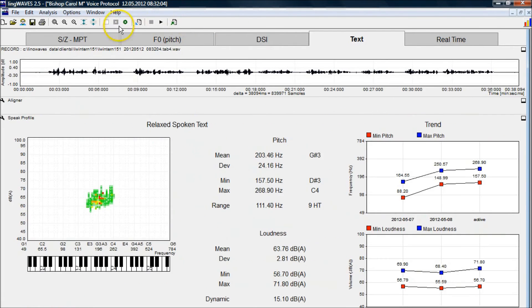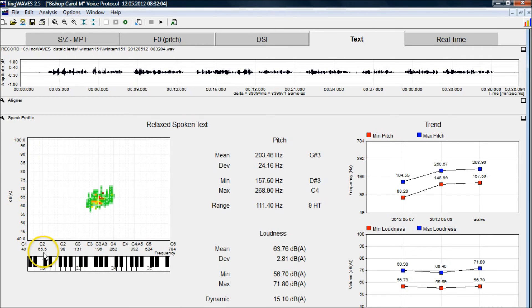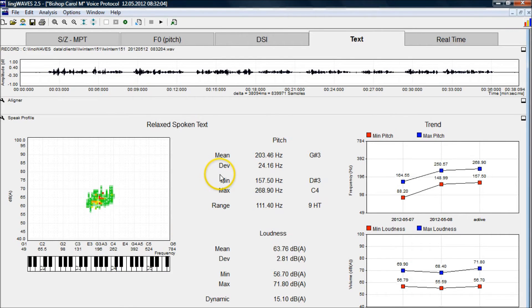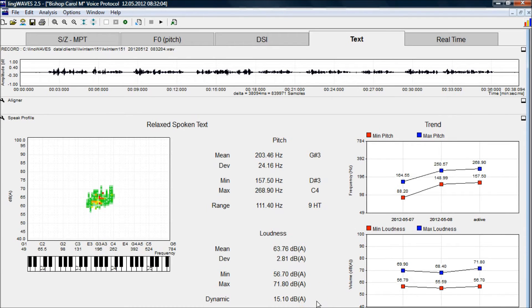We stop the recording and then it analyses it and gives us a voice range profile. It shows the SPL loudness in decibels on the vertical axis and the pitch on the horizontal axis in hertz, corresponding to a piano keyboard. It also gives us the figures for the voice range — the pitch range in hertz and in semitones — and the loudness and the dynamic range. It shows a trend on the different dates when we have reassessed the client.